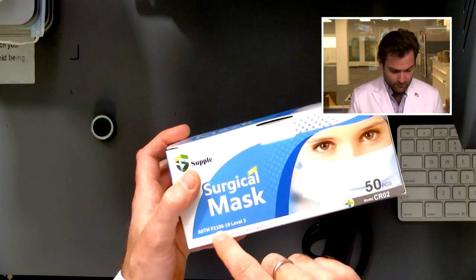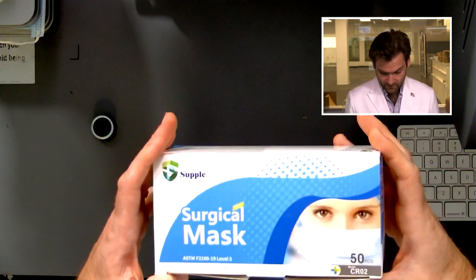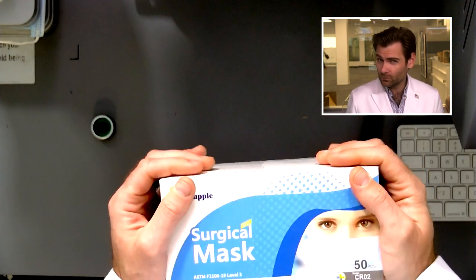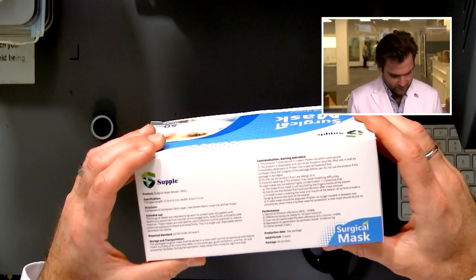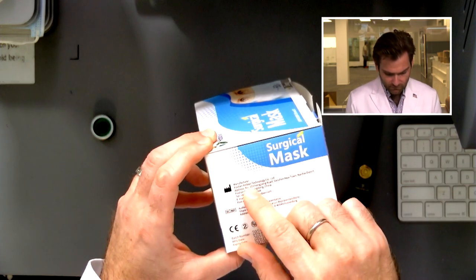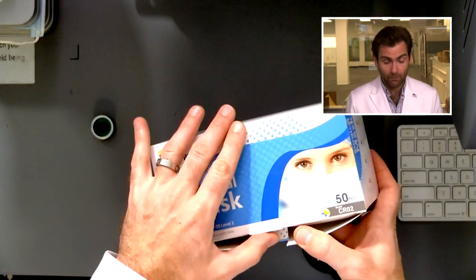This is claiming to be a Level 3 mask — that's a filtration of 98% on a machine just like this. This company is called Supple. I wish their box was a little more supple, but otherwise it seems like a pretty good brand. This one is made in China — we reached out to Foshan Zingbu Technology Co. to get the Supple mask.